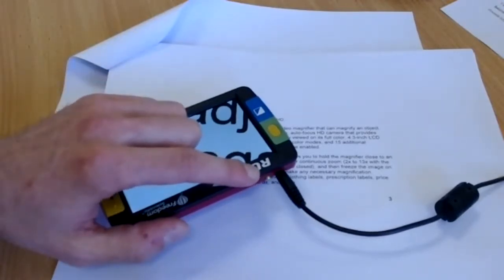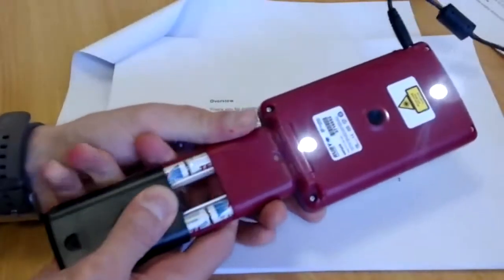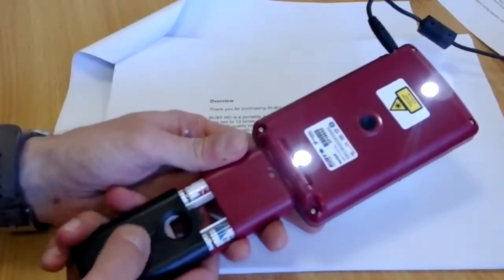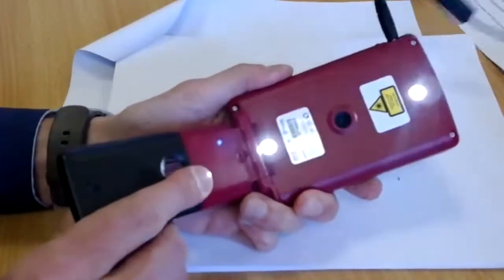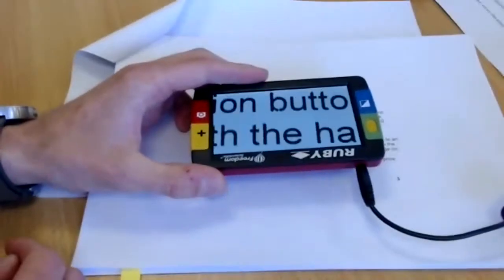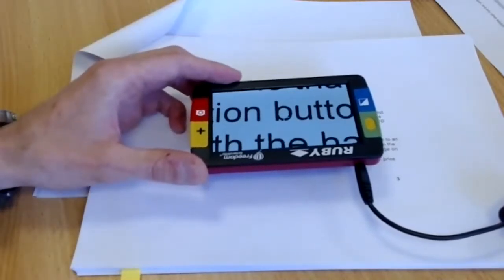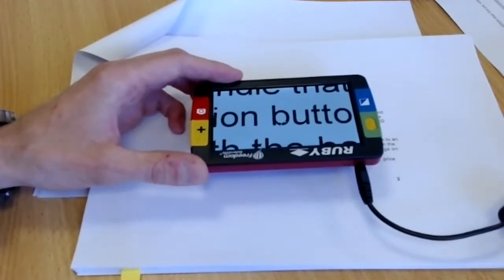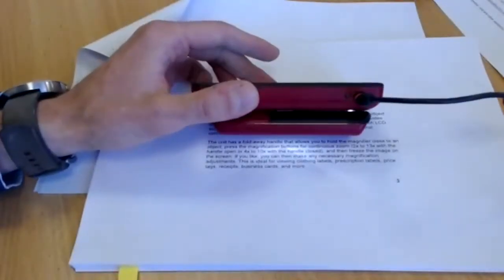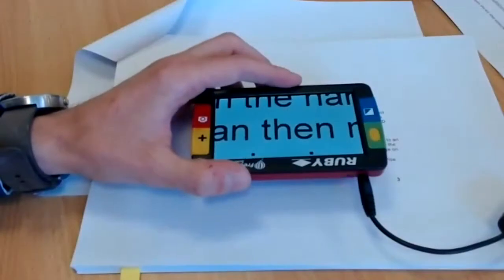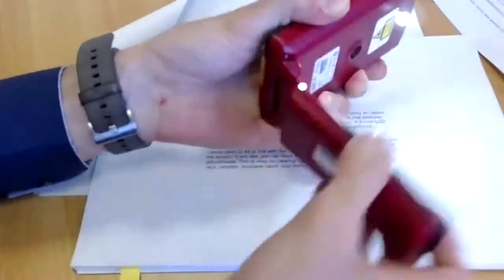If you get a solid red LED, that indicates a charging error — this can happen if you've inserted non-rechargeable batteries, since the device can't charge those. It can also indicate faulty or worn batteries. Try replacing the batteries and it should return to flashing green when charging. Non-rechargeable batteries will technically work but will run out quickly, so try to always use rechargeables.